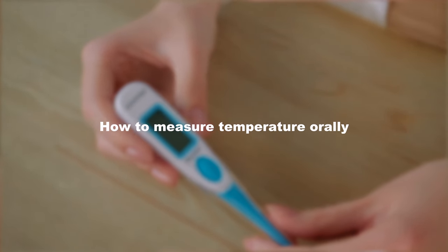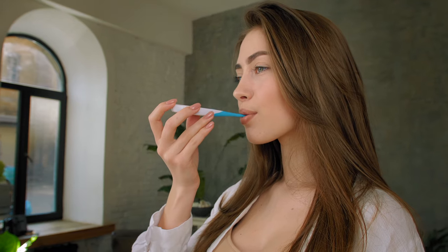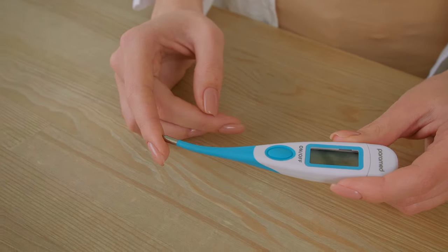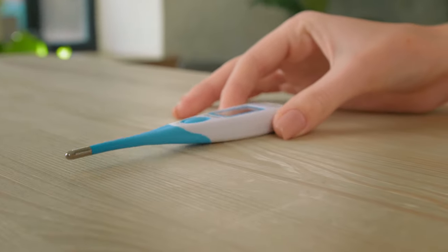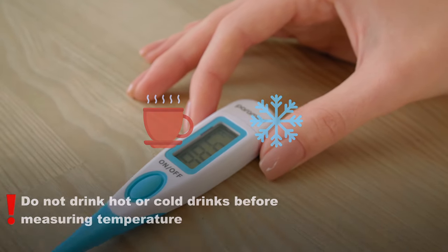How to measure temperature orally. Place the thermometer under the tongue, close your mouth and breathe through your nose. The flexible device tip allows you to do this very easily. After the signal you can remove the device and see the result. Do not consume cold or hot drinks before measurement.